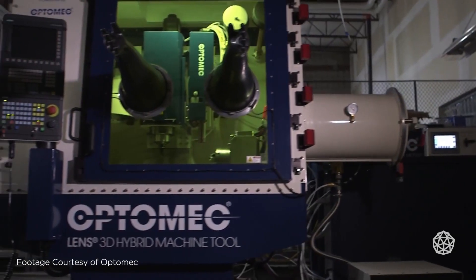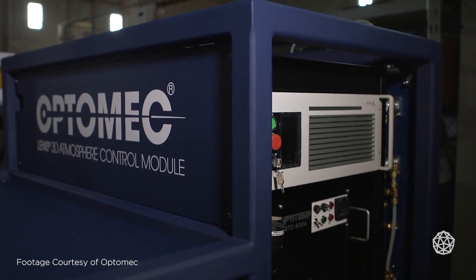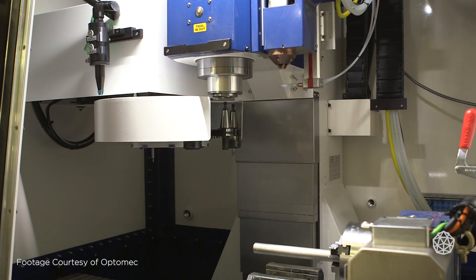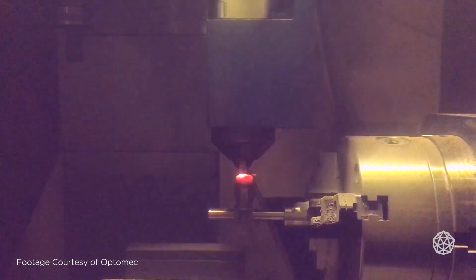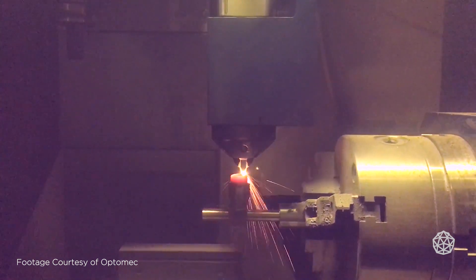You've got the laser deposition head for your additive, and then you have a 16-tool turret changer for the subtractive side. They also offer that in a controlled atmosphere, so if you're working with reactive metals like titanium, aluminum, or magnesium and you need an inert atmosphere, you can get an argon purge — in either additive only or additive and subtractive, which they call hybrid.